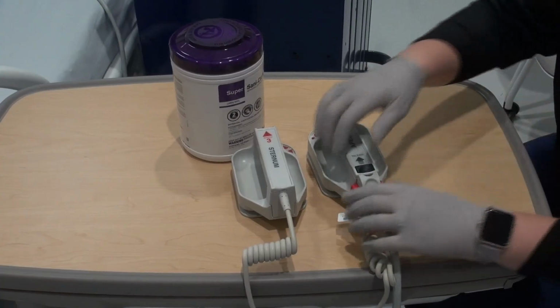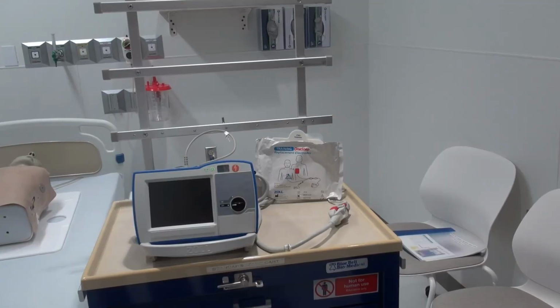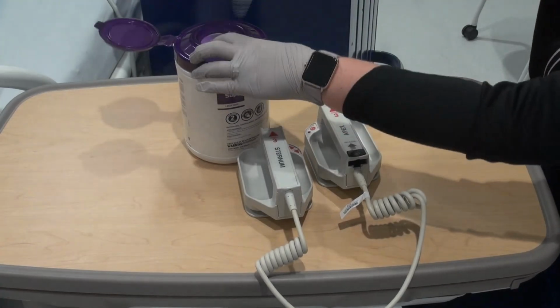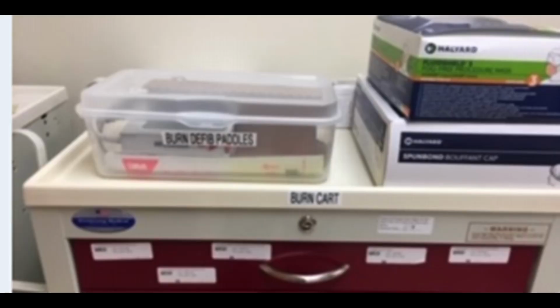After use, paddles should be removed and disconnected from Zoll and the one-step pads attached. The paddles should be cleaned with Sani wipes and returned to the storage box. Place the storage box in the appropriate location on your unit.